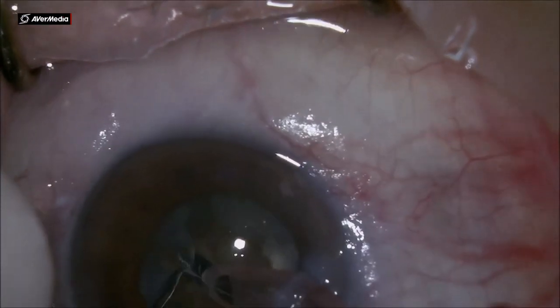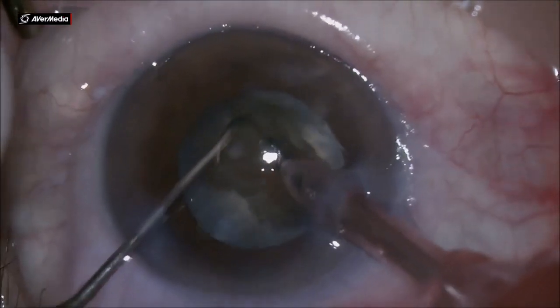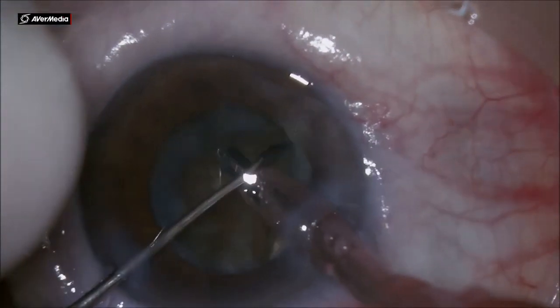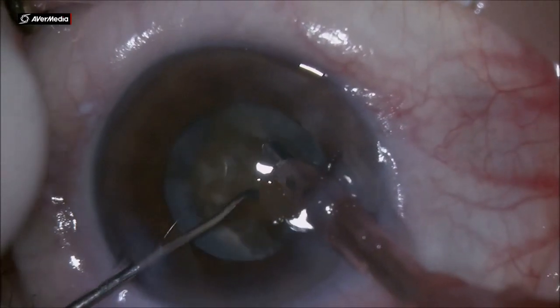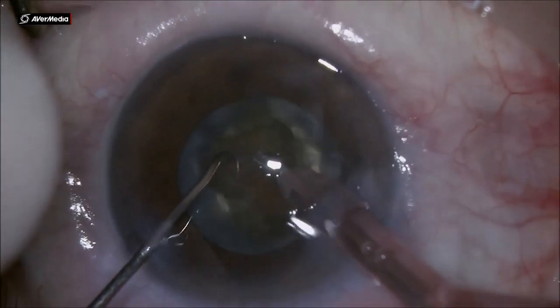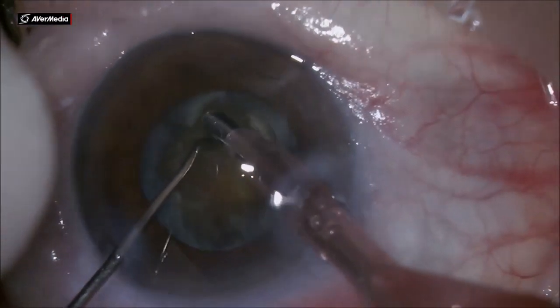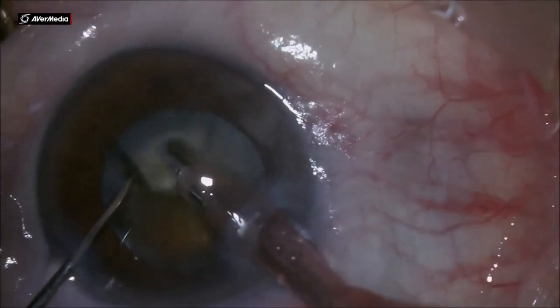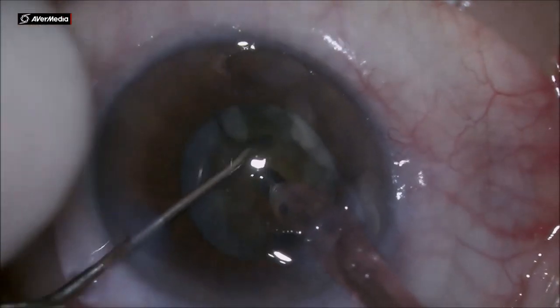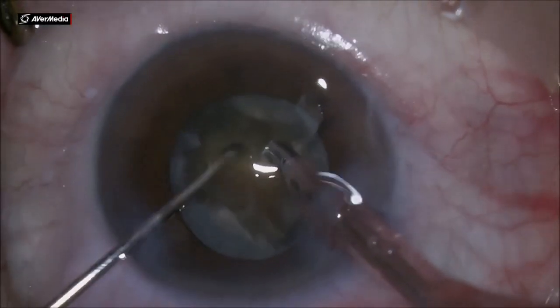The phaco emulsification probe is having a hard time to chew these two big chunks of leathery cataract, so we have to keep chopping and make the fragments as small as possible, in order for the aspiration and vacuum to work more than ultrasound. Through this small capsular opening the pieces have a hard time to be taken out, but we need patience.